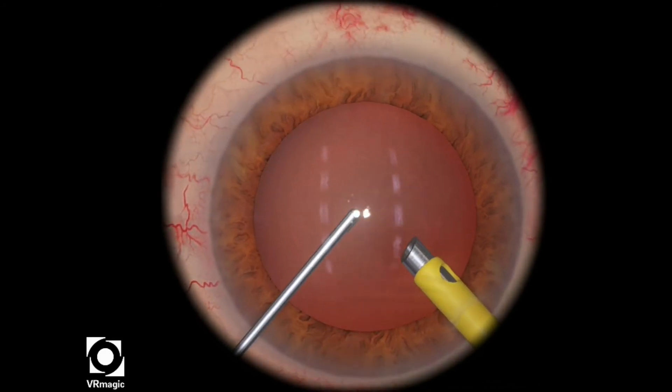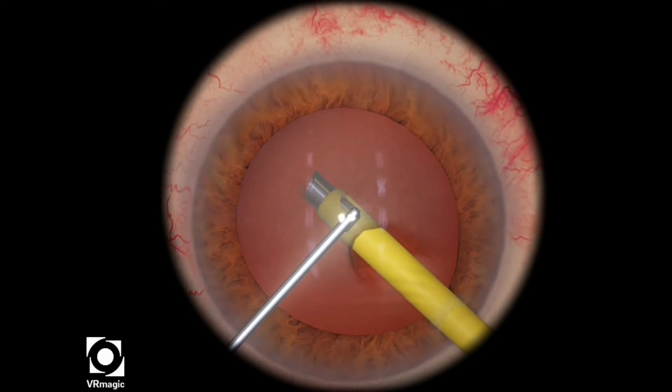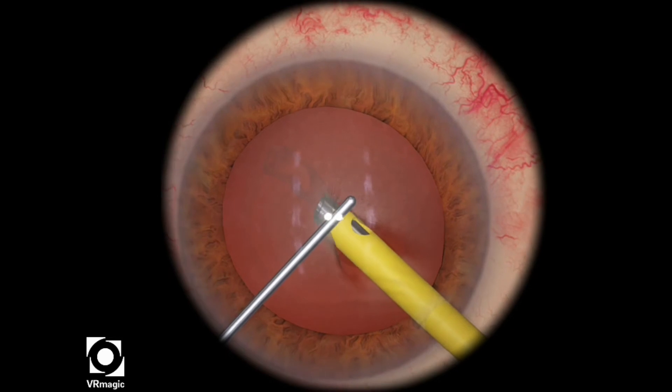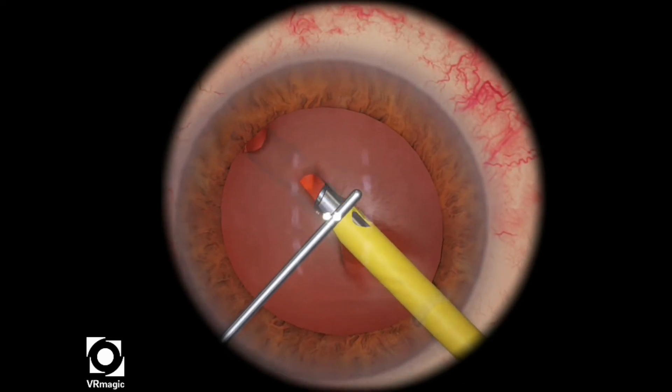Enter into the eye, remember continuous irrigation. Just dig your FACO tip a little bit. I'm actually underneath the lens surface, and then I go and start to make a little bit more of an opening.